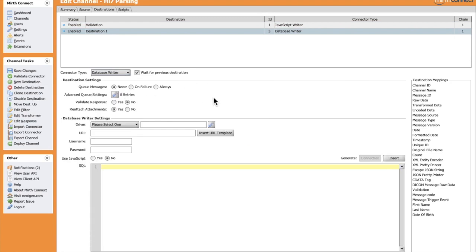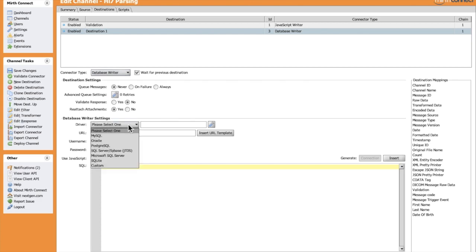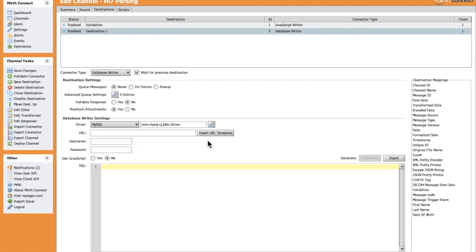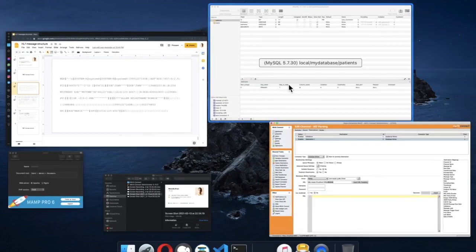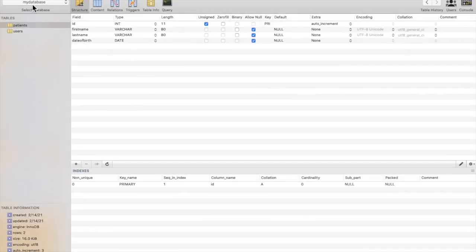Here we have some configuration. For the writer settings, we can choose MySQL. Let's insert the URL template and modify it. We have a local database, so localhost, and the port is the default port 3306. The database name is MyDatabase.